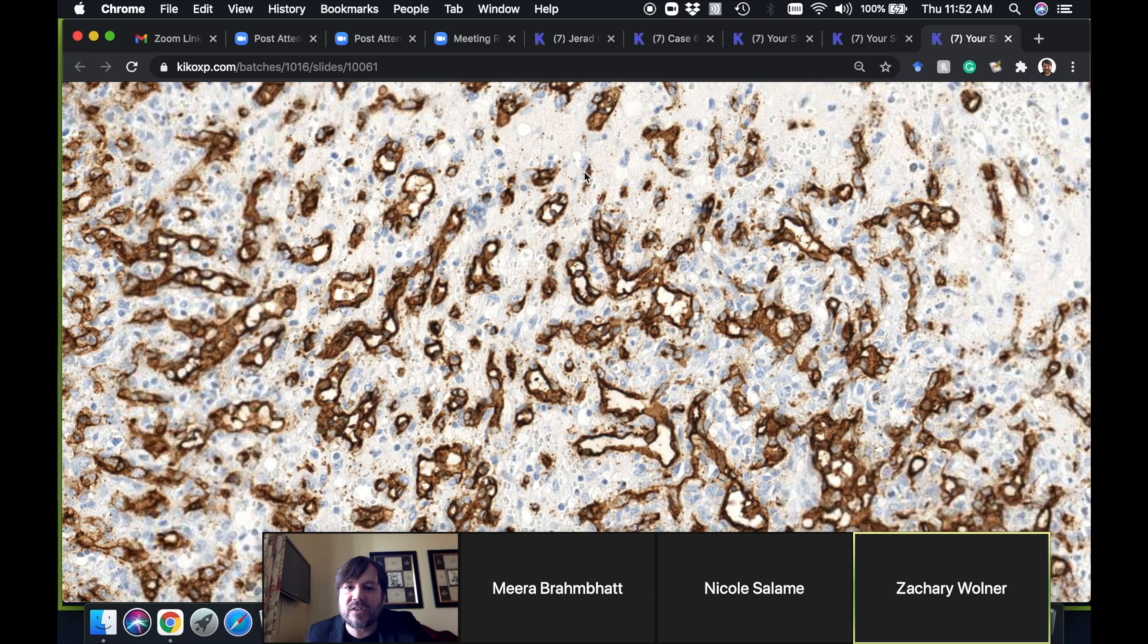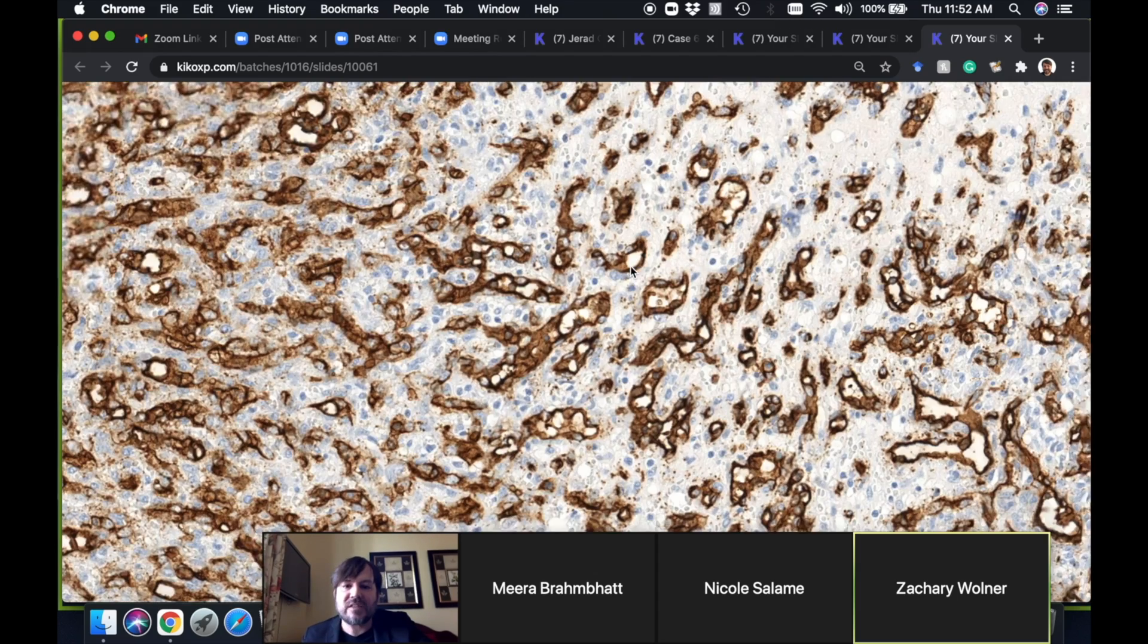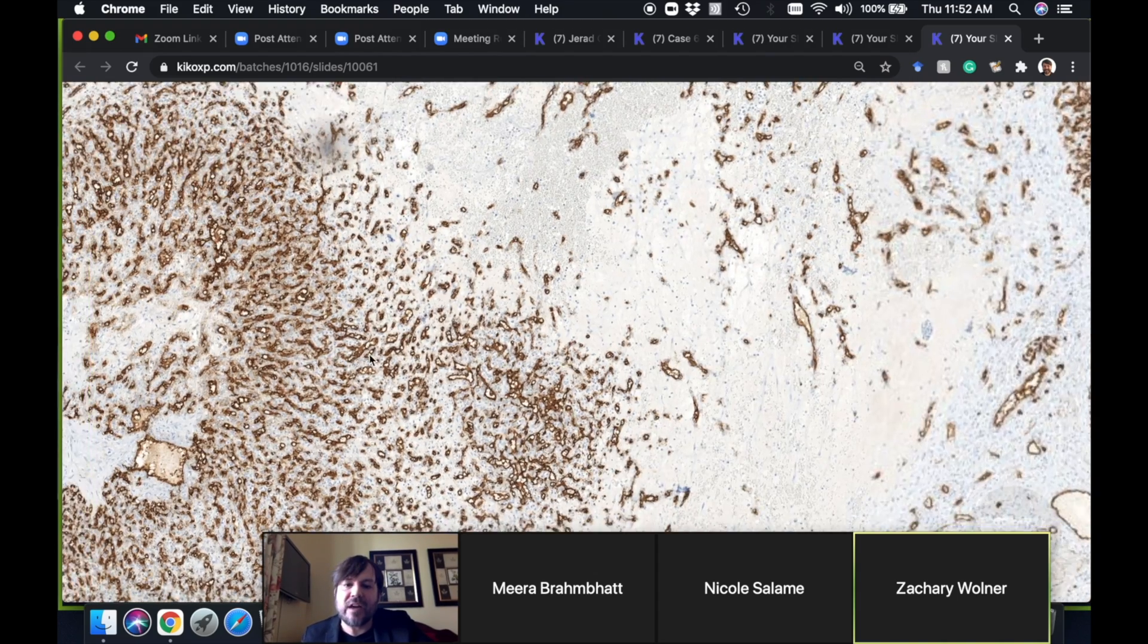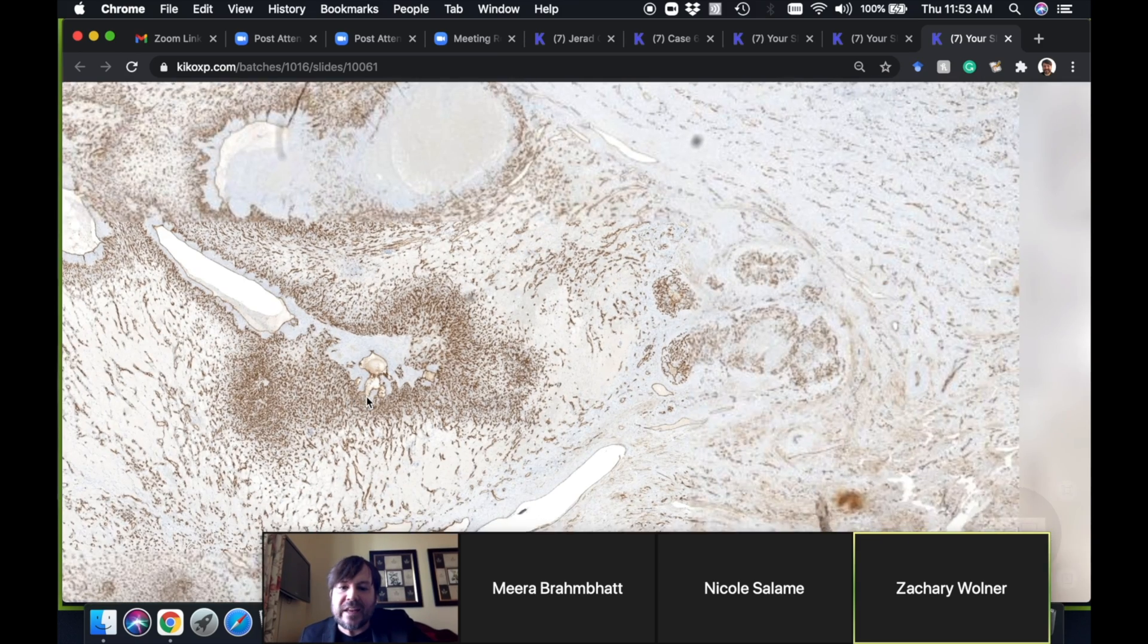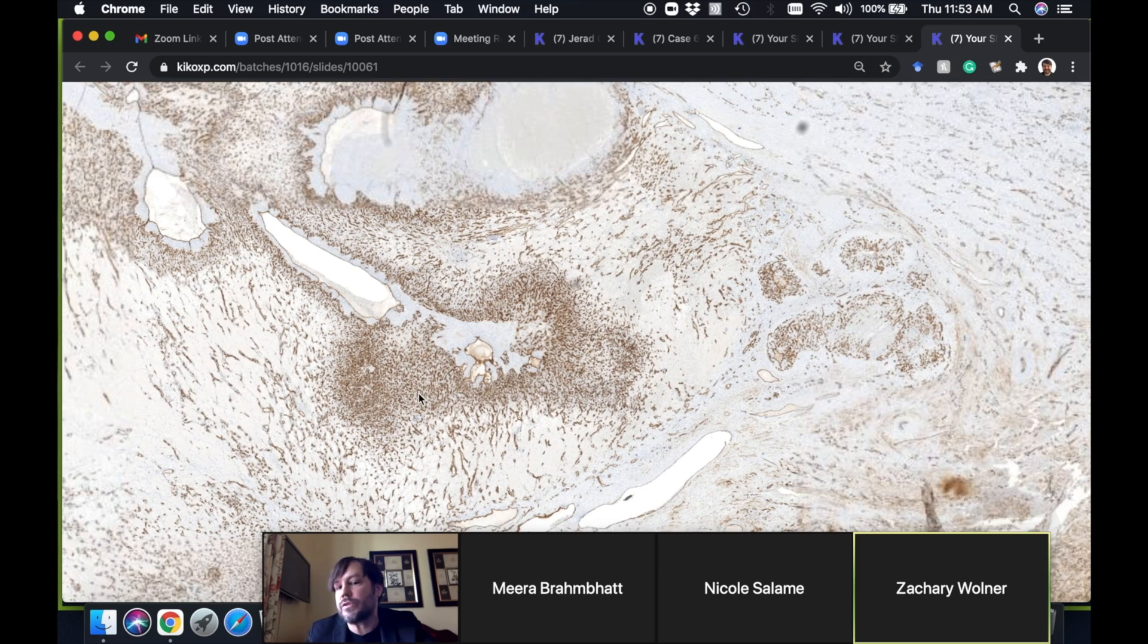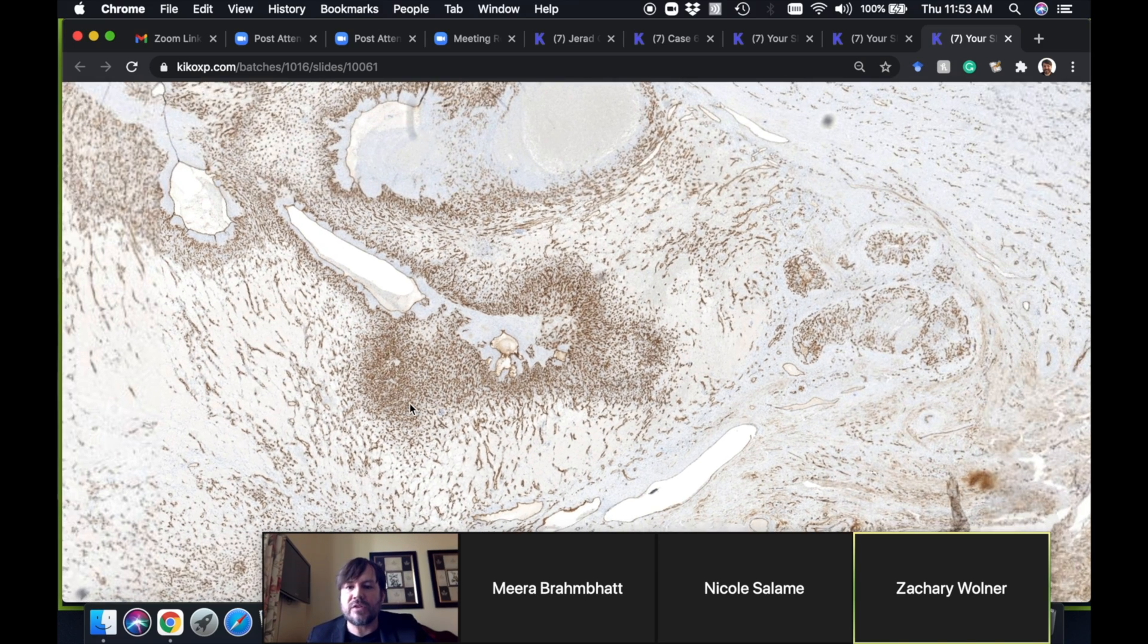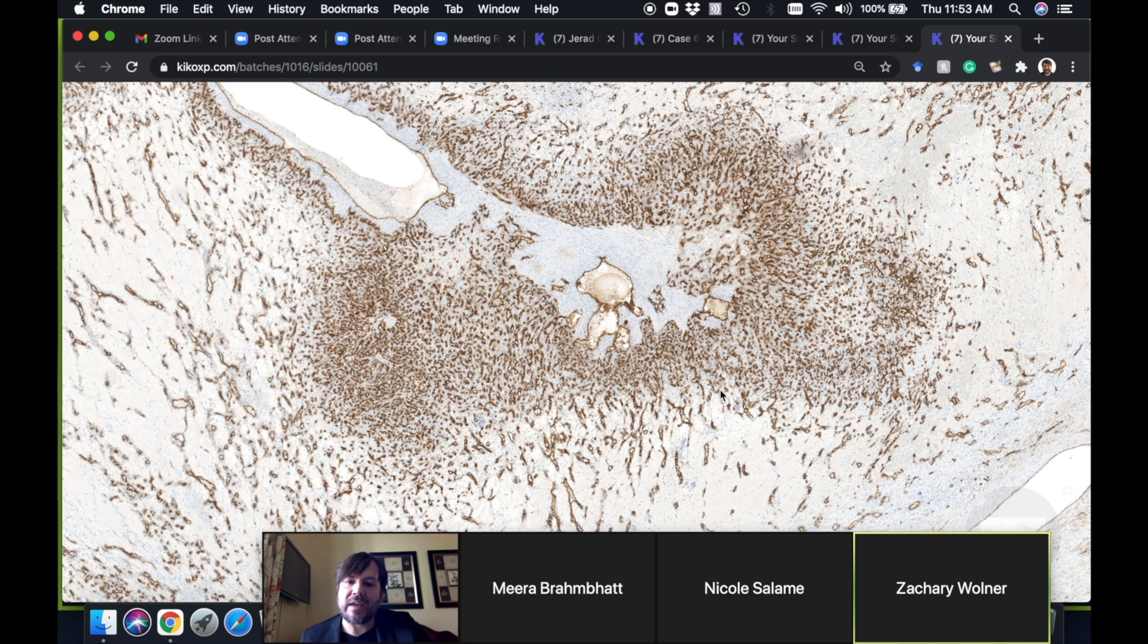Each of these little things—you get these little tiny vessels and they're nice and well formed. You can see much more clearly here, look at the lobular pattern there. It really enhances and highlights that pattern. Again, with practice you can usually do this on H&E, but I've definitely found it helpful in certain cases that the CD31 stain can really highlight that pattern and make it easier to visualize.